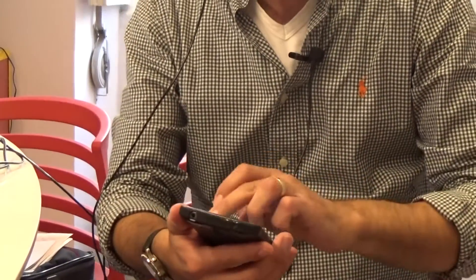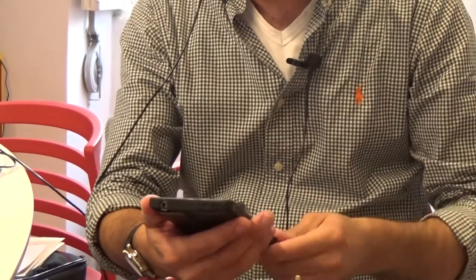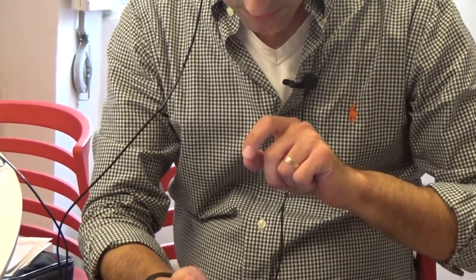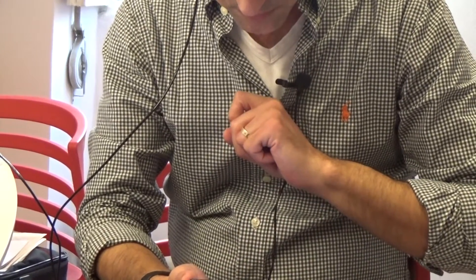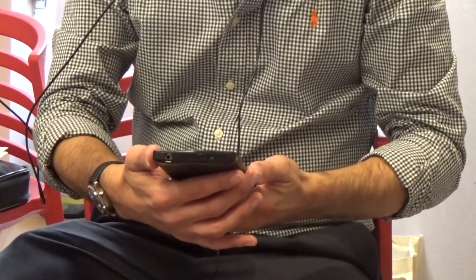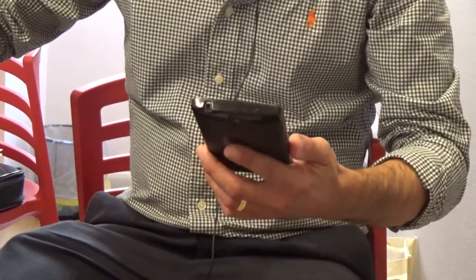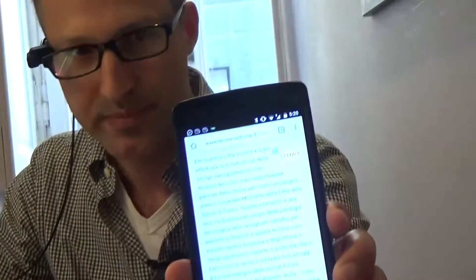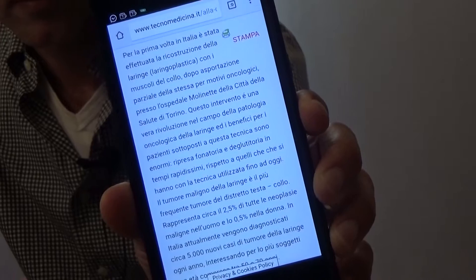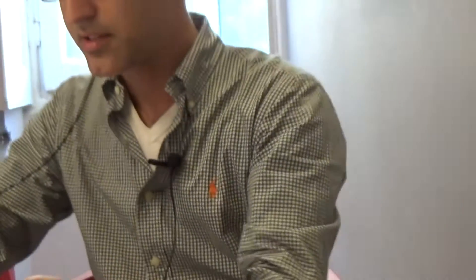I'll show you one other example, which is reading from digital text — reading from my smartphone. I'm just going to point my finger at the text that I want to read from my phone. Okay, here we go. So that's text reading.